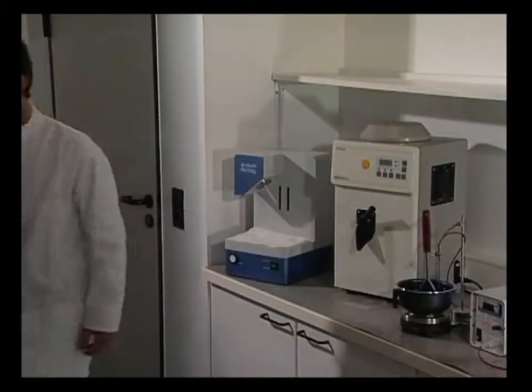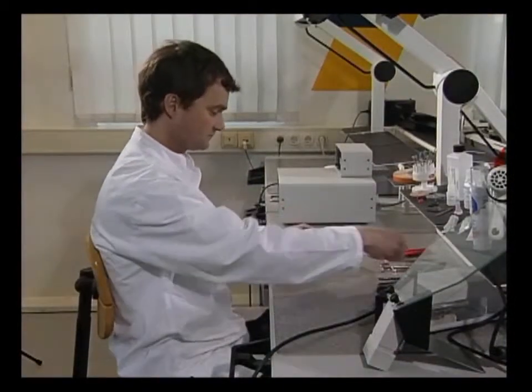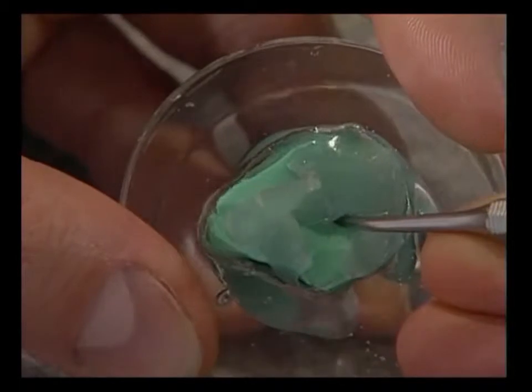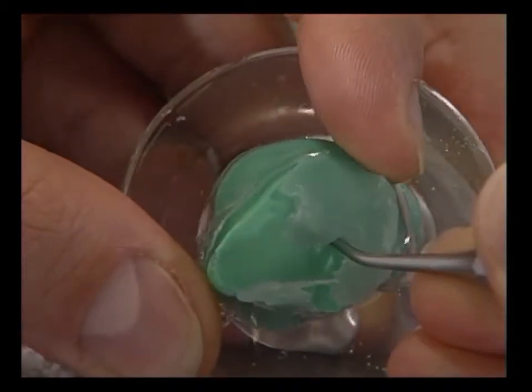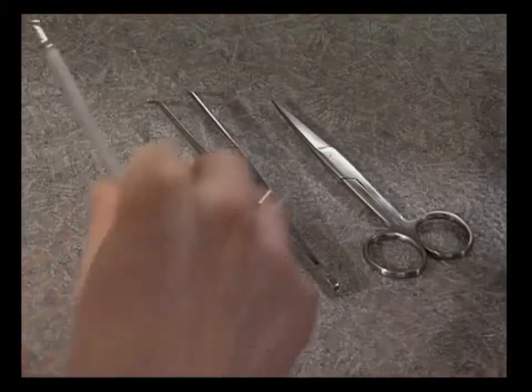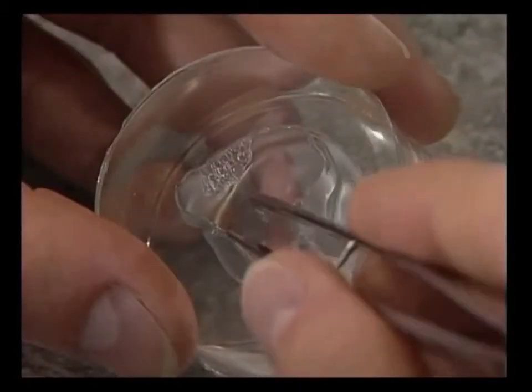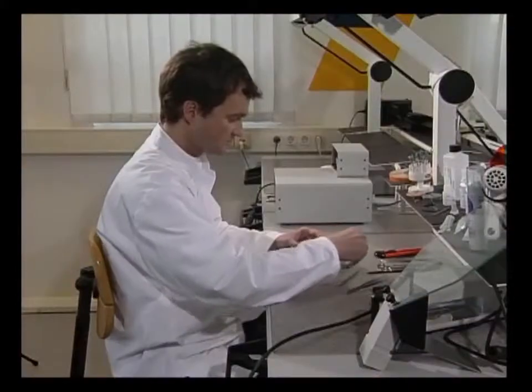Some 10 to 12 minutes later, the control form is cured. The impression is taken out of the silicone with the impression removing instrument. Any dipping wax still remaining in the negative form is removed with tweezers or blown out with compressed air.